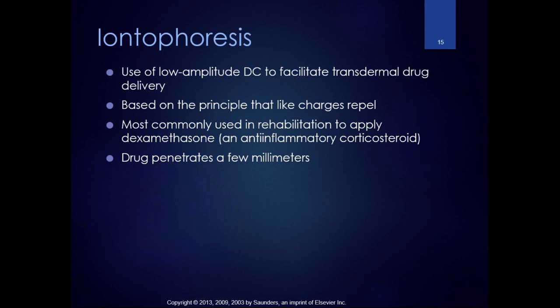So the drug penetrates a few millimeters. That's perfect for a foot because feet aren't that deep. If you were trying to do something at another location that had thicker tissue, it might not work as well. Another good place for it is elbow, anything with thin tissue.